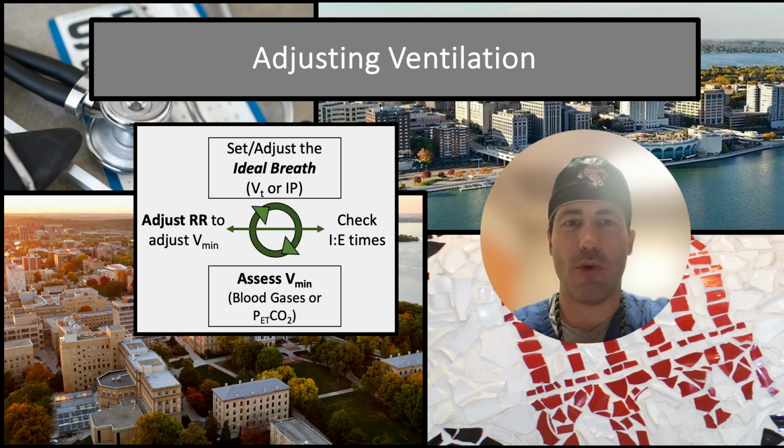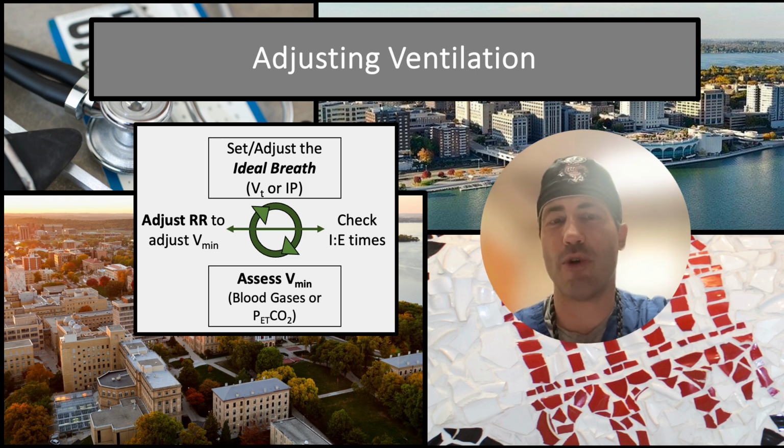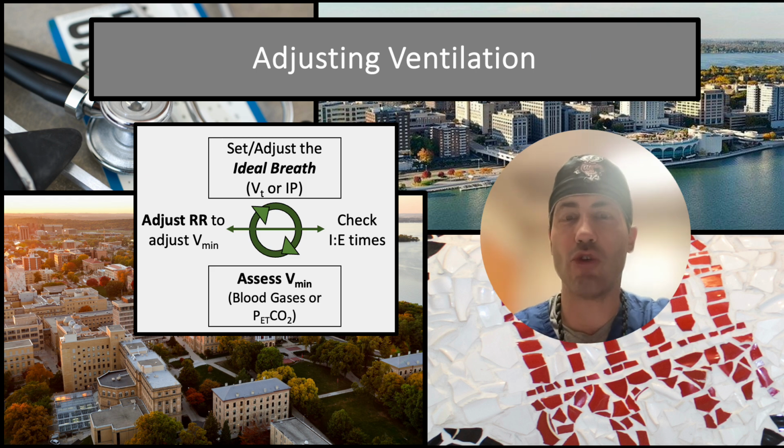All right, so what do we do to set a ventilator? First, you pick a starting point and adjust it for that safe, perfect breath. You want the most volume that can be comfortable, but is also safe and not a high amount of pressure to get that breath.